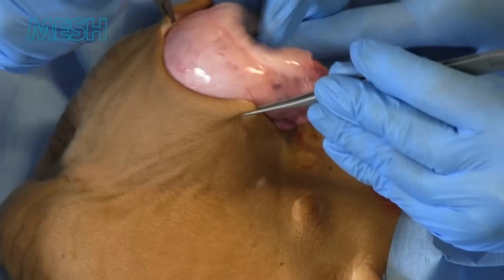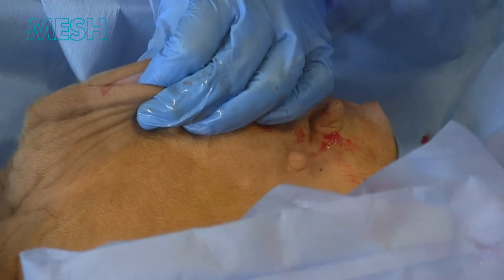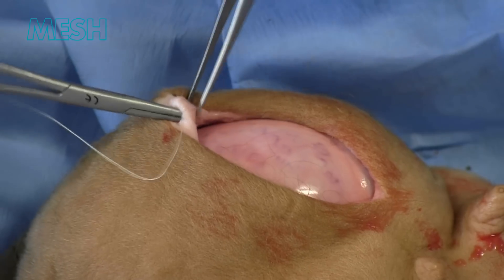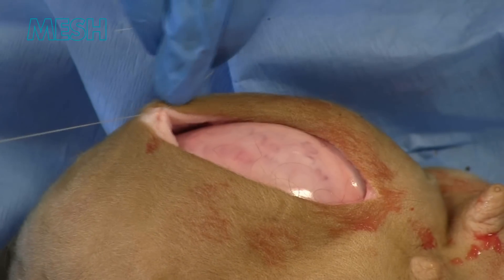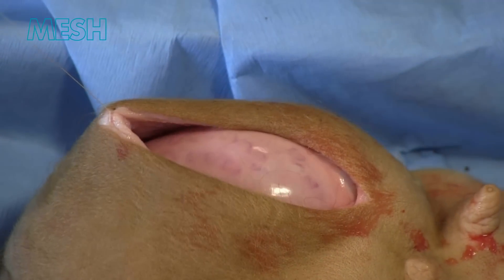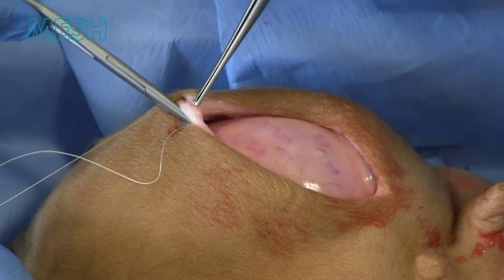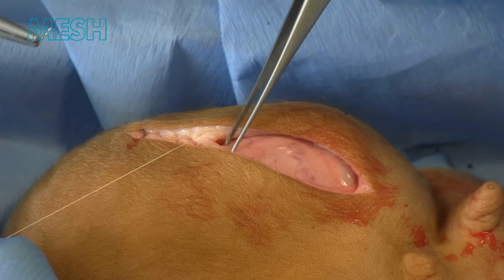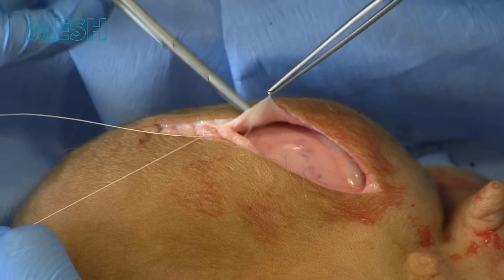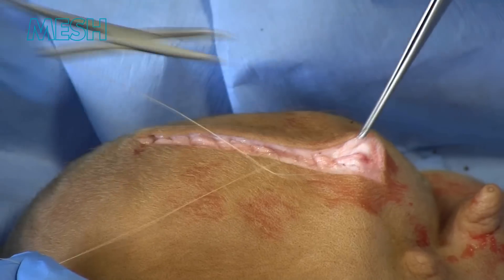Traction is then placed on the edges of your incision and the testicle replaced in the correct lie back into the scrotum. In terms of closure, initially we close DARTOS using 2-0 vicryl in a continuous suture. This is hemostatic and we usually cut and then allow your assistant to follow your suture from one side, continuing to close the incision. At this stage, some people do place local anaesthetic around the incision, which can help with postoperative pain relief.